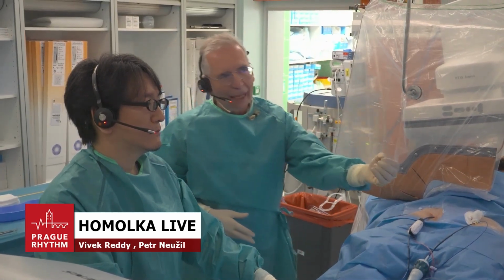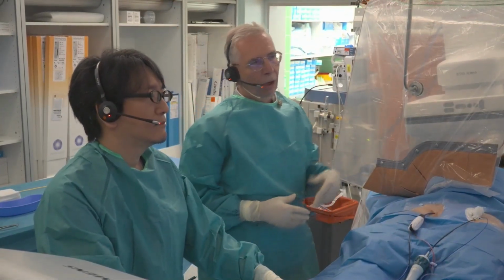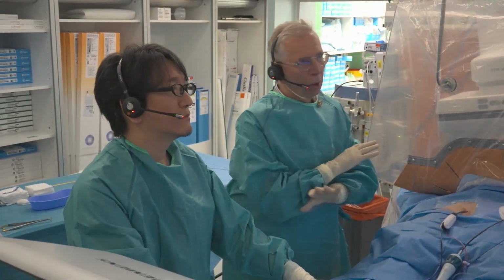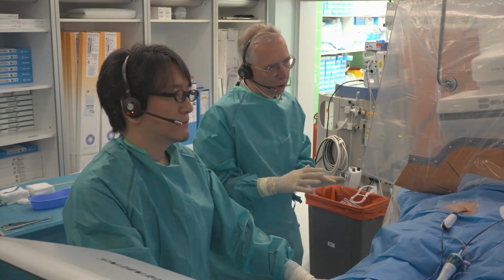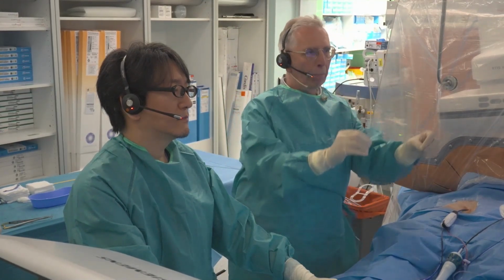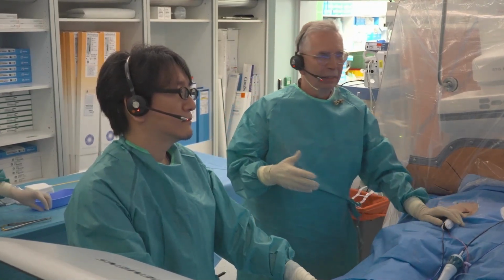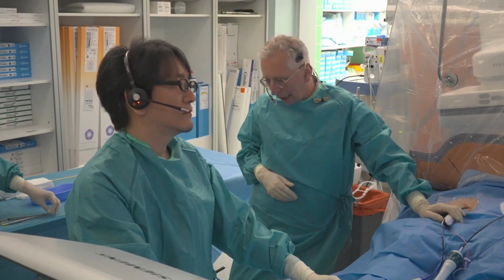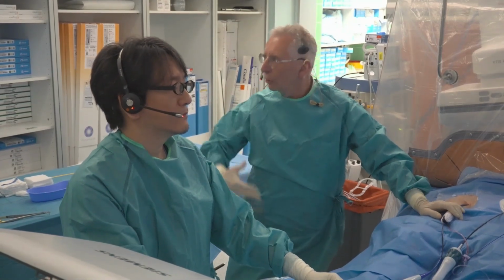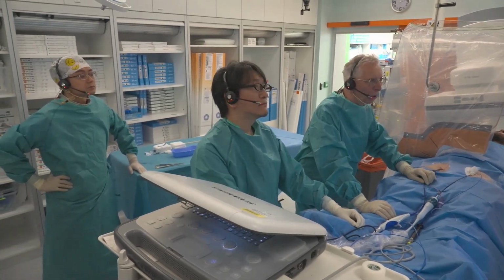When you have no navigation, it was a fluoro system only, so a fluoro-only procedure. Or if you have no ICE, you cannot control the contact. So I wouldn't like to rely on the MANIFEST data at all in terms of the posterior wall, but it's a good decision to do it in persistent patients. I really want to show conversion. So we never go for cardioversion after PVI. When we decide to go for the posterior wall, we try to get conversion by ablation itself. But I'm not relying on the potentials.